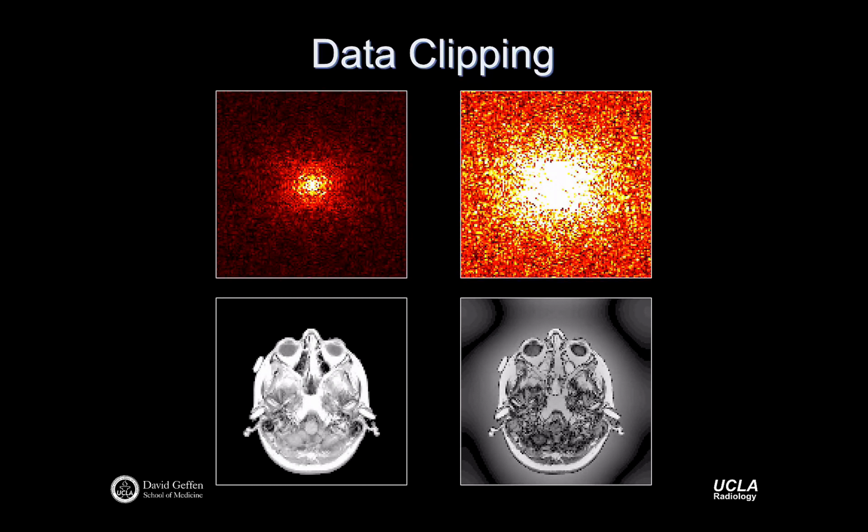Now imagine that my K-space data that I acquired is supposed to be a mountain, but now it's more like a mesa. It's been chopped off at the top, and all of the signal intensities at the top are effectively the same. Then you get these really kind of hazy artifacts across the whole field of view, disrupting, obviously, the overall image contrast as well. It's not a very common artifact anymore because these systems are pretty good at automatically adjusting the receiver gains.